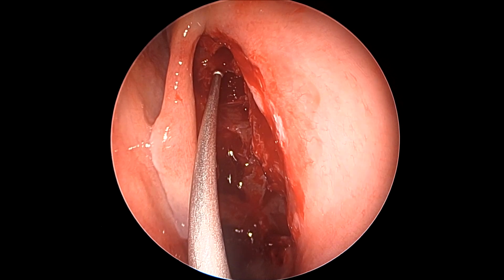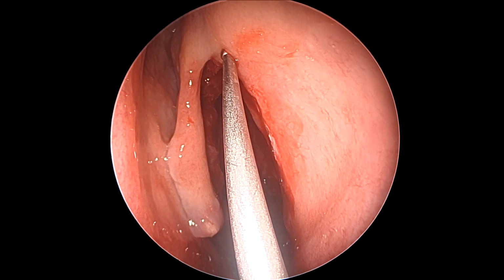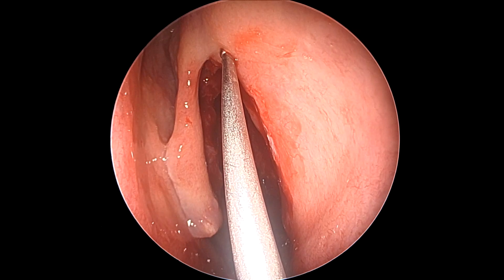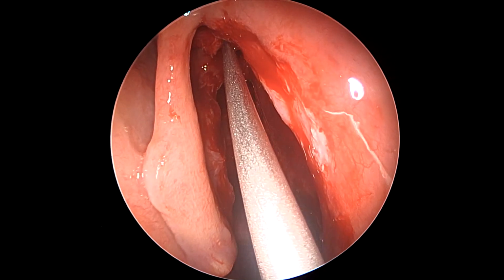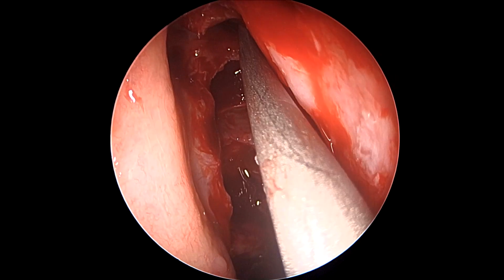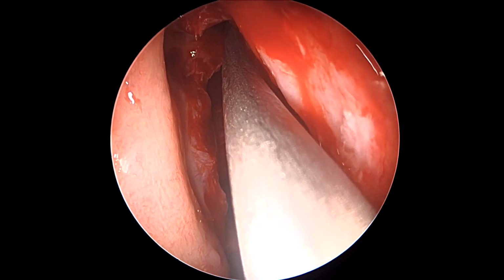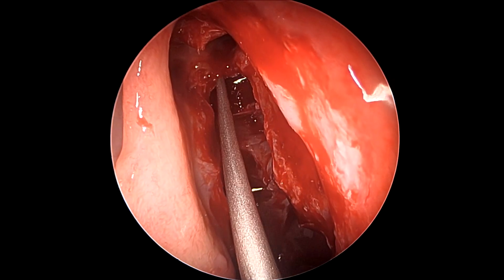And this is again a curved navigator probe showing us that this is the anterior wall of the agger nasi on the left side, just immediately lateral and superior to the axilla of the middle turbinate, behind which lies the agger nasi and the frontal recess. And here, as you see, it leads straight towards the frontal sinus.